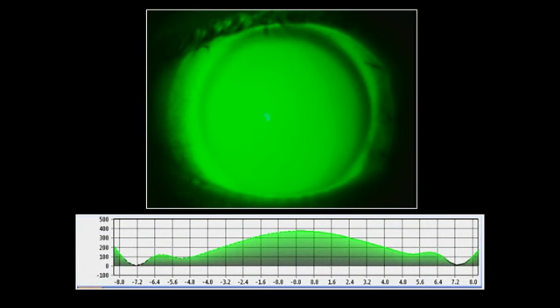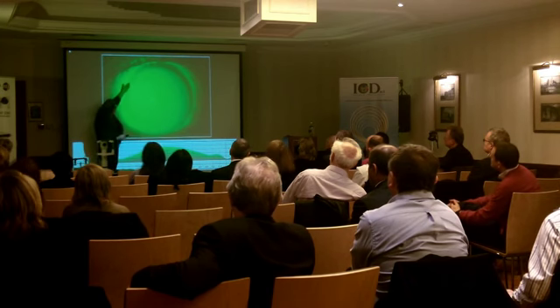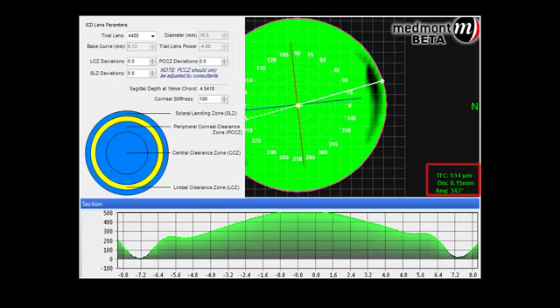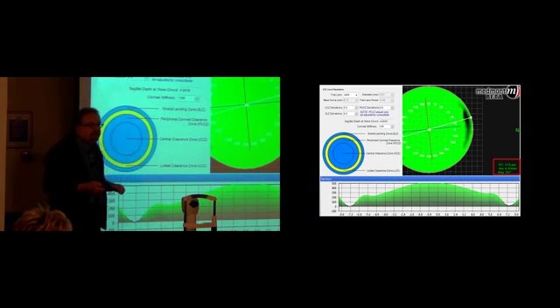So here we see the actual lens on the patient's eye. We can see on this nasal side our anticipated thinning, but we're actually seeing some thinning out here on the temporal side. So now we highlight the area of that scleral landing or limbal clearance zone, and we increase that 5 degrees.